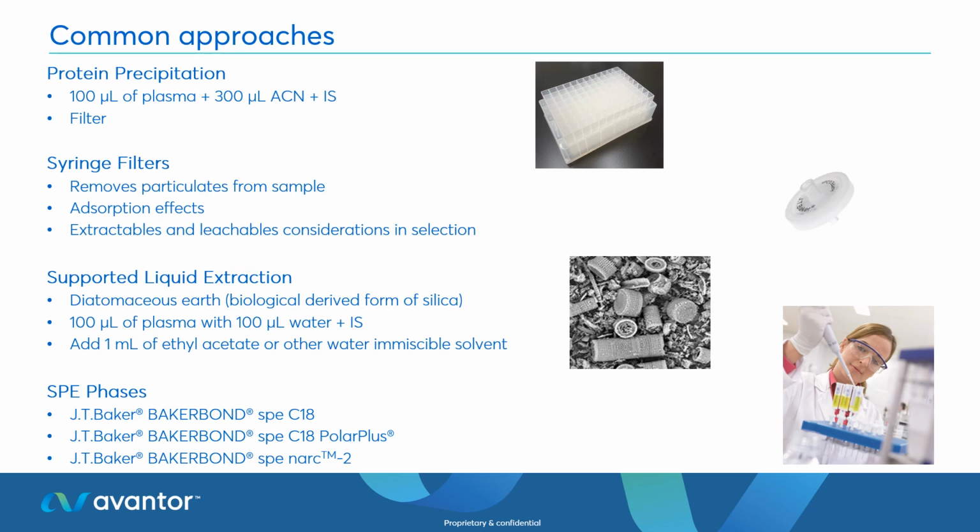Supported liquid extraction is an alternative technique to liquid extraction and utilizes the immense surface area that you have with diatomaceous earth, a biologically derived form of silica, to ensure that you get good mass transfer between an inherently hydrophobic phase and an inherently hydrophilic phase, if you like, some form of organic solvent such as hexane and some form of aqueous solvent such as water.